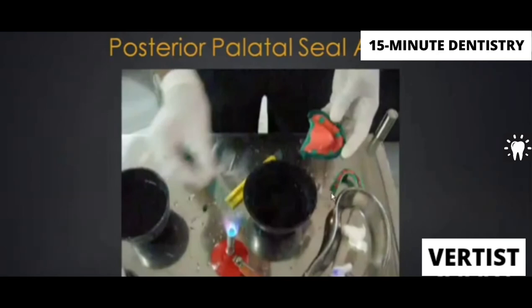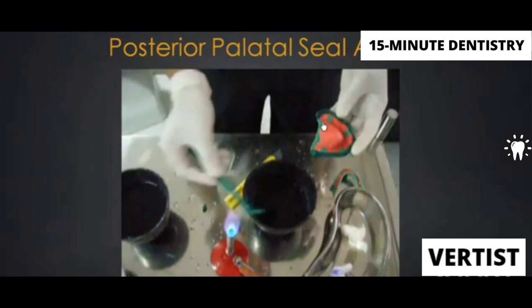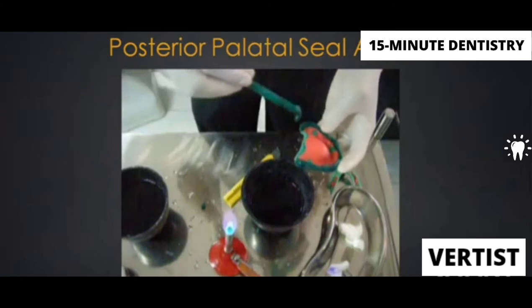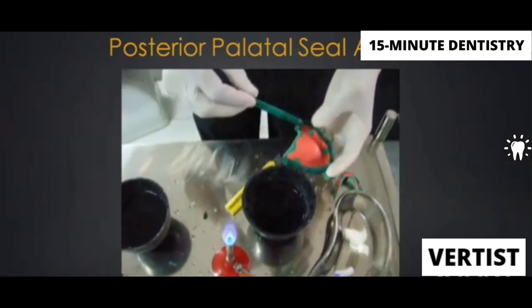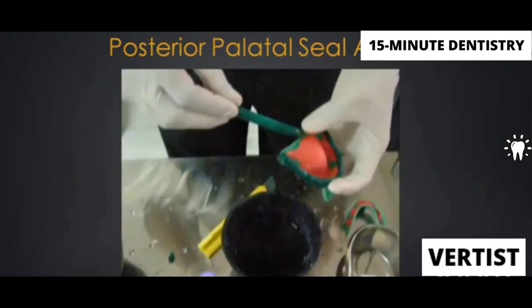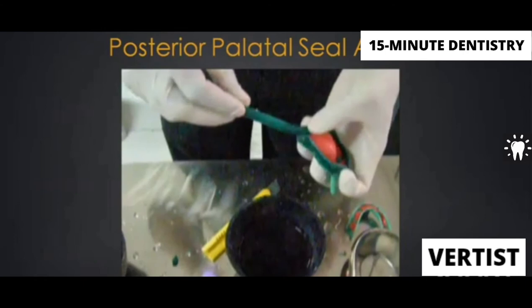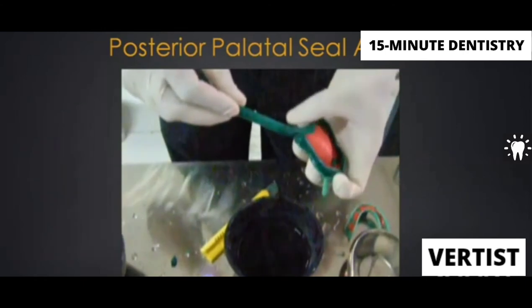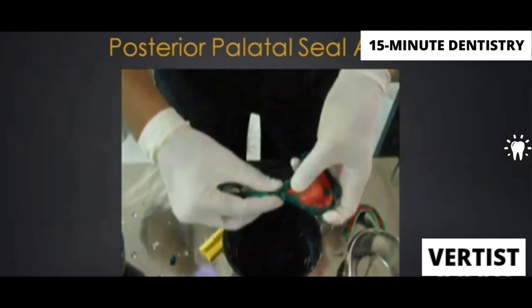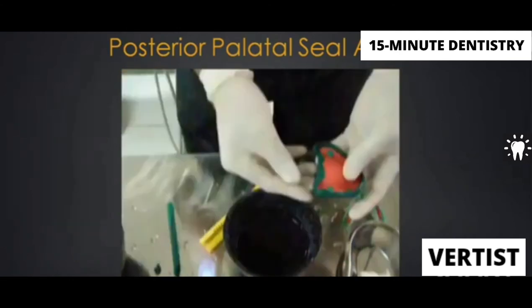I hope this plays. This is also again very important. Now in the posterior palatal seal region, we are supposed to add according to the cupid bow shape. Okay. Don't forget that. We are supposed to add only according to cupid bow shape. And second most important is, don't add anything beyond the tray. For the posterior palatal seal area, the material has to be added on the tray. You have cut back the wax spacer. There is some space on the tray. The material has to be added only on that space and in cupid bow shape.